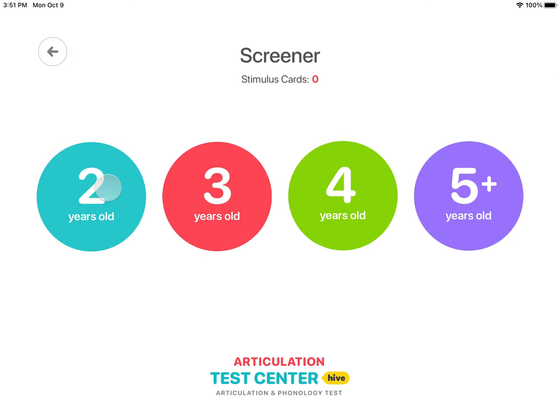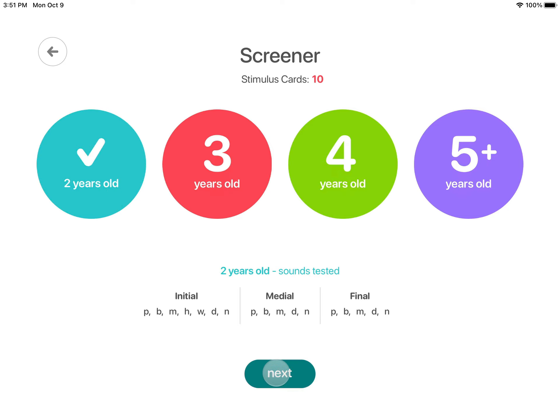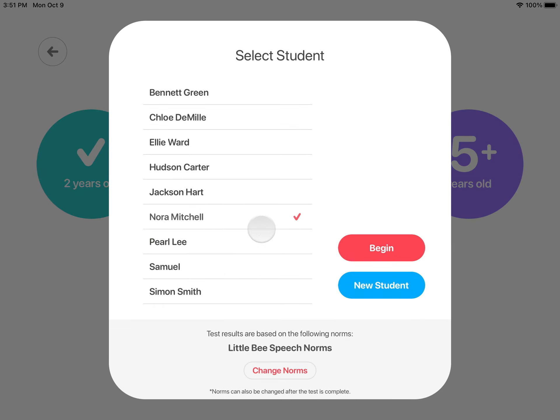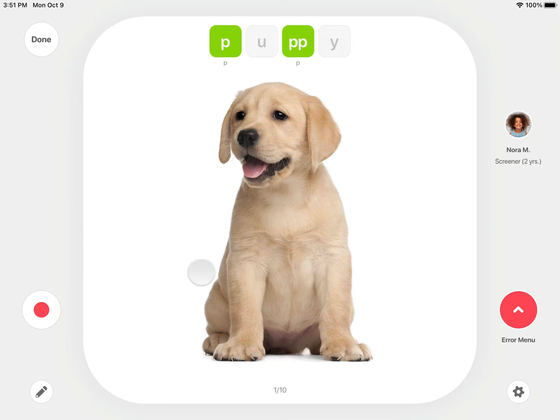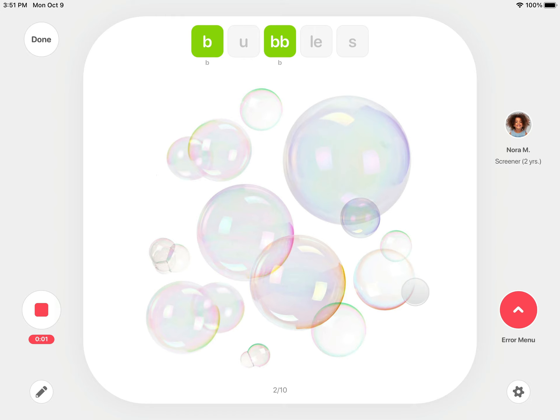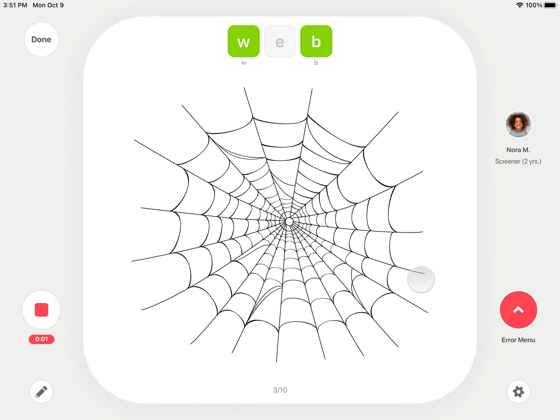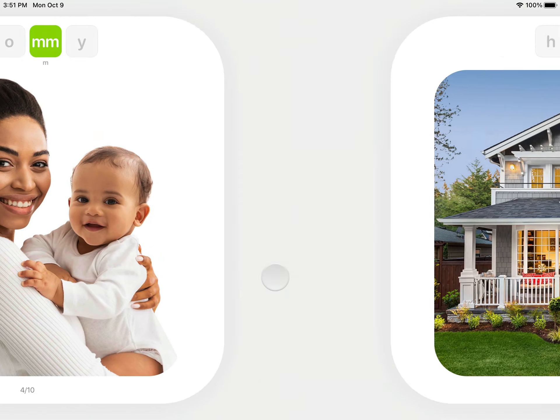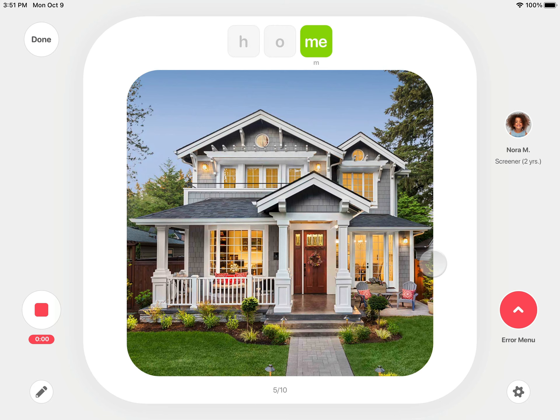Once you've selected a test or screener, choose the student you are testing. Begin the assessment by tapping Record, then have the student say each word. You can stop the recording and play back their productions. Otherwise, the recording will continue as you proceed through the cards, saving each recording with the associated stimulus word.